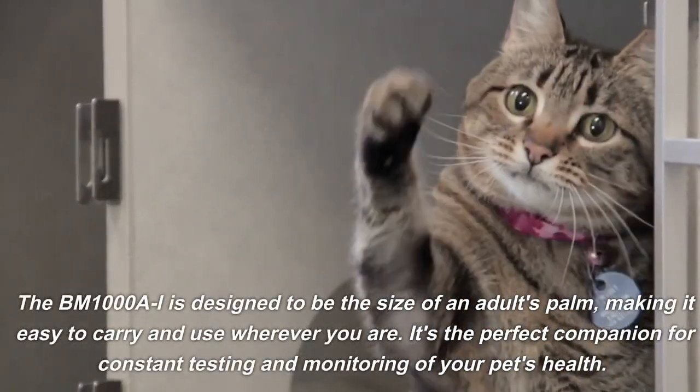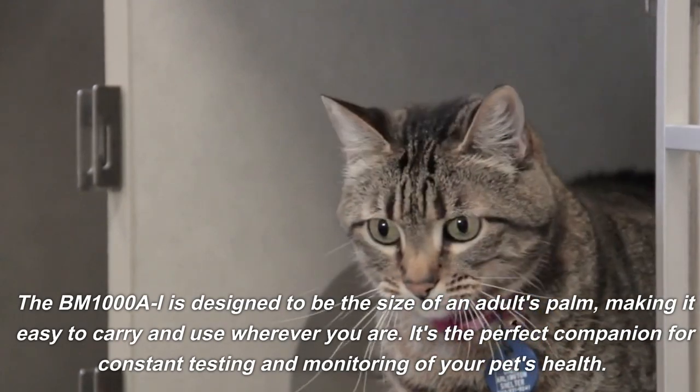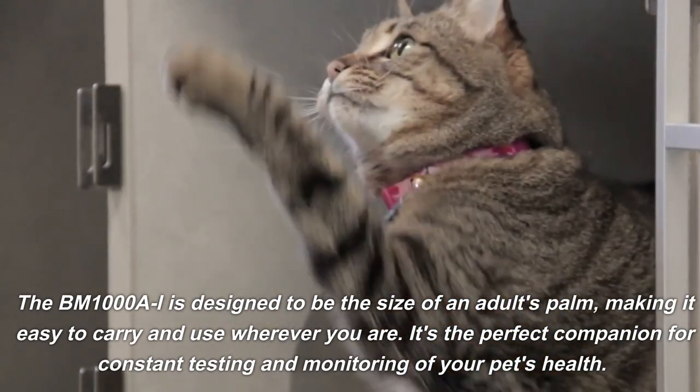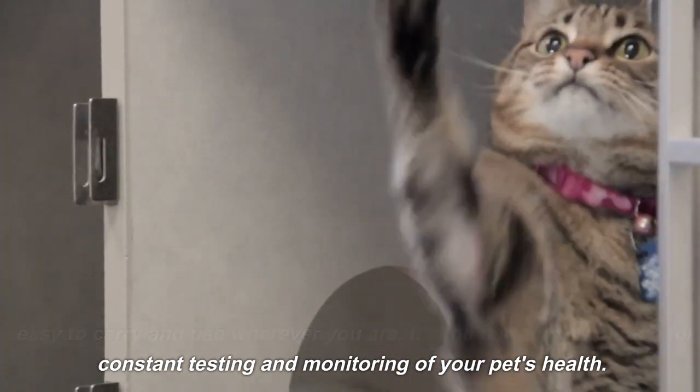The BM1000AI is designed to be the size of an adult's palm, making it easy to carry and use wherever you are. It's the perfect companion for constant testing and monitoring of your pet's health.